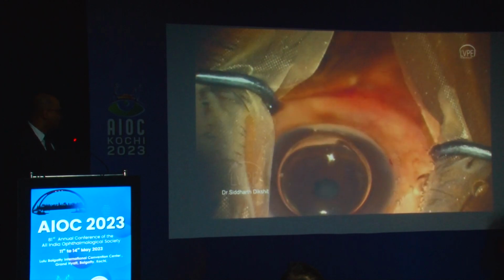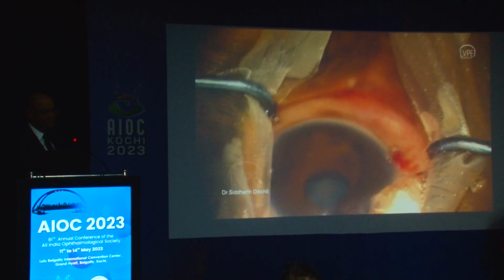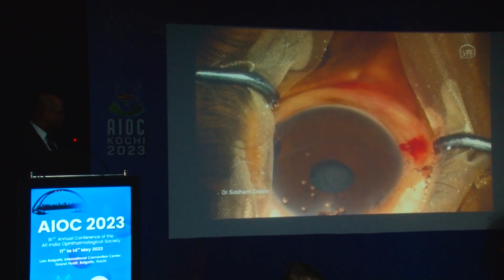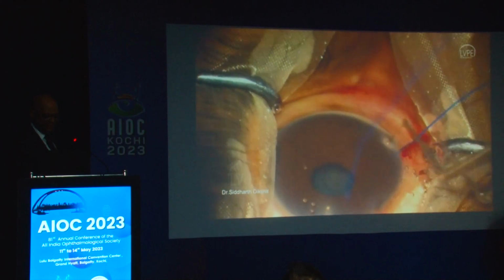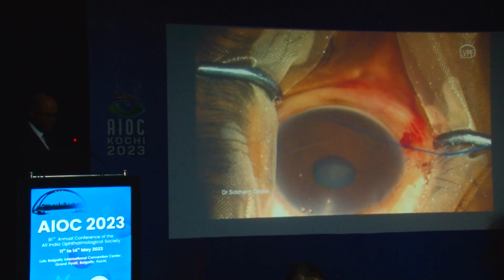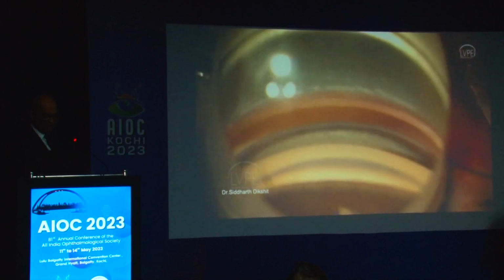It's a clear lens. And the side port that I make with this MVR blade for goniotomy is right opposite, on the nasal side, which gives you the best access. I always use a cohesive viscoelastic or a gel for the intracameral and dispersive viscoelastic on the eye. So everything has to go in first before you put the gonio lens. This is because after gaining some experience, you are confident that you will not struggle with the view. So once you are used to it, you can get the view immediately.